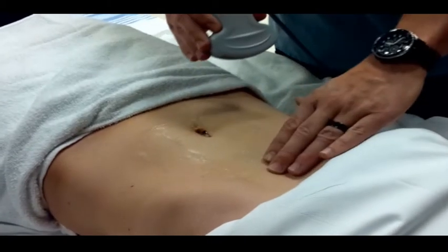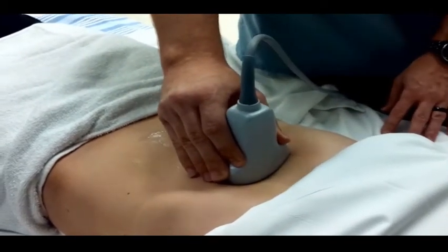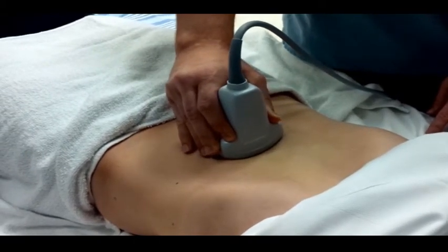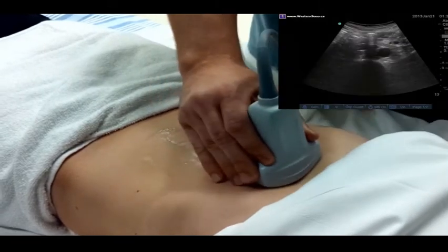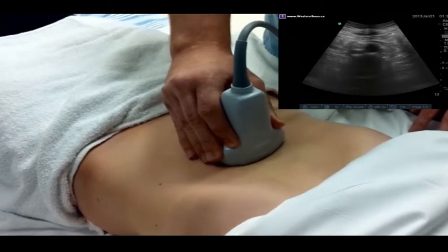Here we can see the ultrasonographer palpates for the xiphoid process, places the probe in true transverse plane, and slowly sweeps down the length of the aorta towards its bifurcation. As we review the scanning technique, we can also now see a representative ultrasound clip showing the expected findings of this study on screen.